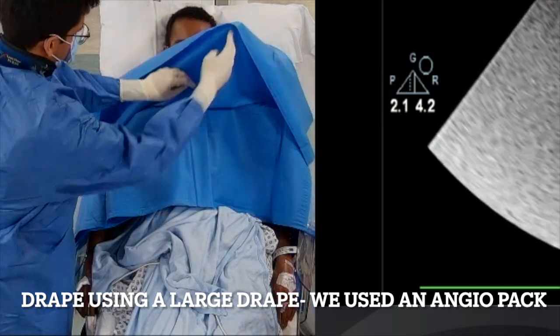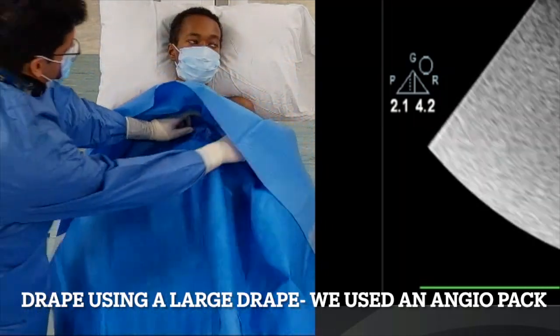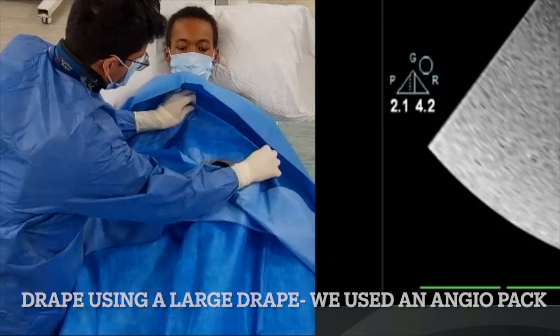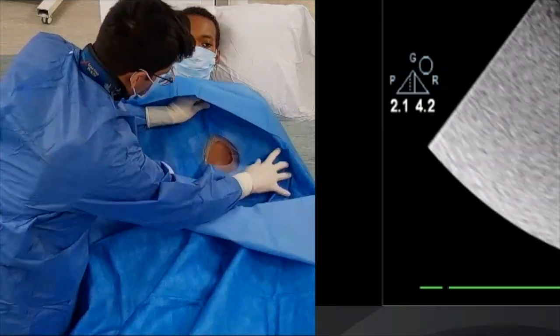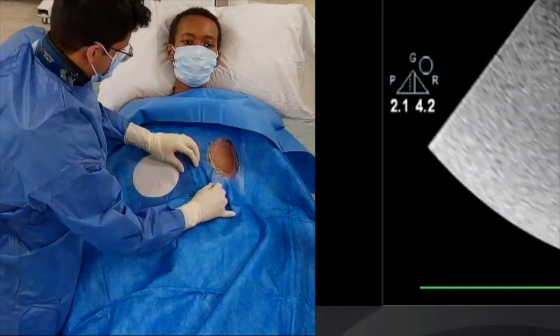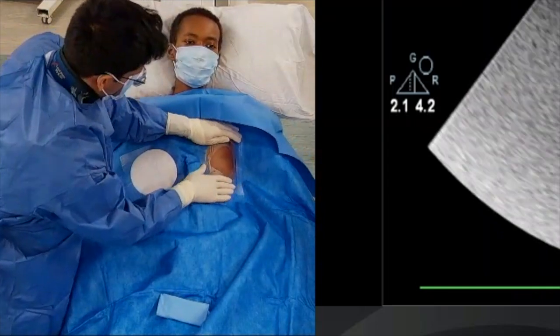As my registrar drapes things up and tucks the drapes underneath the chin, we can see there is one hole sitting over the target zone on the apex of the heart. Once that's all stuck down, we're ready to confirm we're still in the right spot — there's no point blindly putting a needle in.